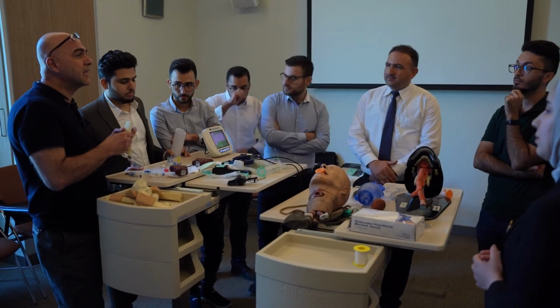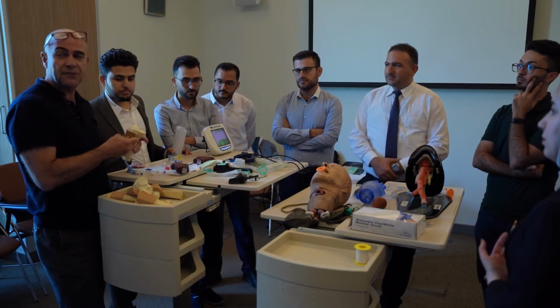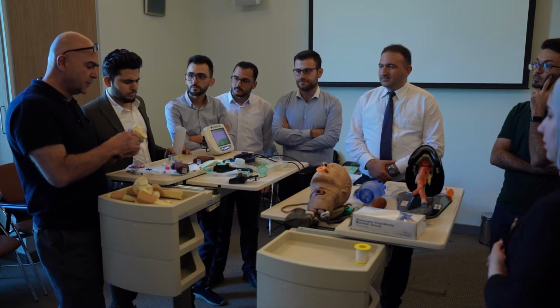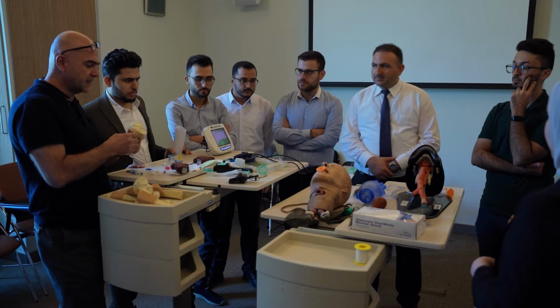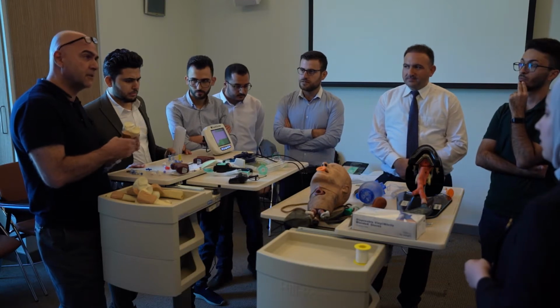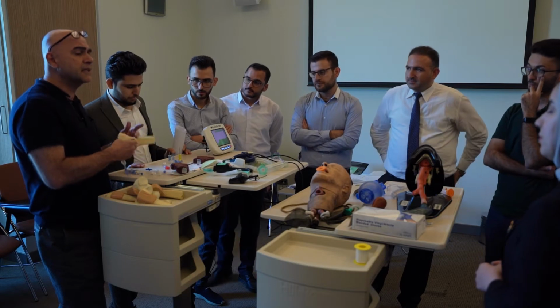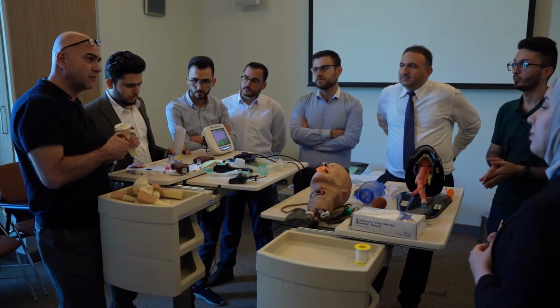The other scenario is the unconscious patient. Every unconscious patient, the airway is at risk. So how are we going to open the airway? Head tilt, chin lift. Okay, good, excellent. And if a cervical spine injury is suspected, you are going to use jaw thrust. Good. And if there is any foreign body, secretion, blood, or vomiting inside the mouth, you are going to evacuate it by suction.